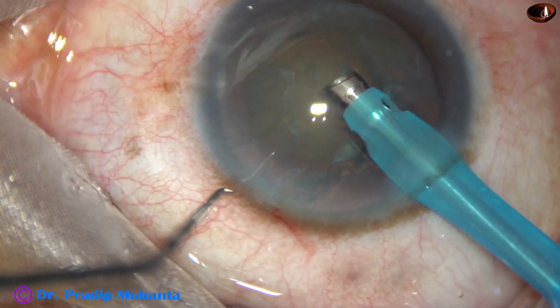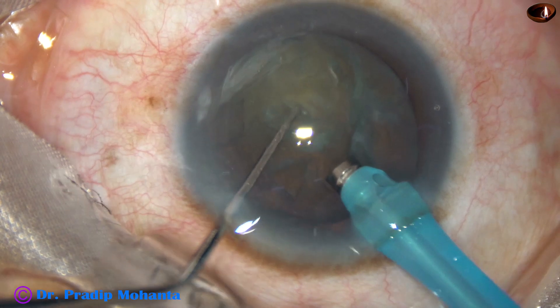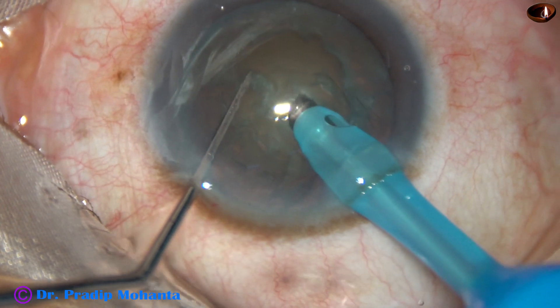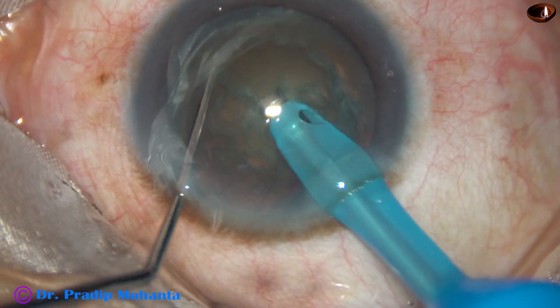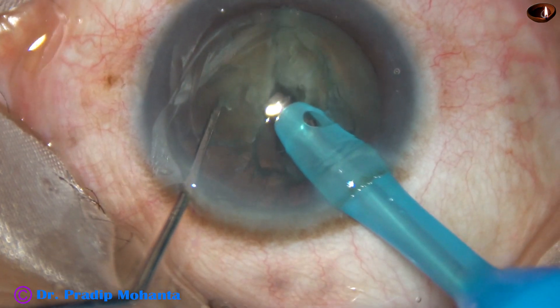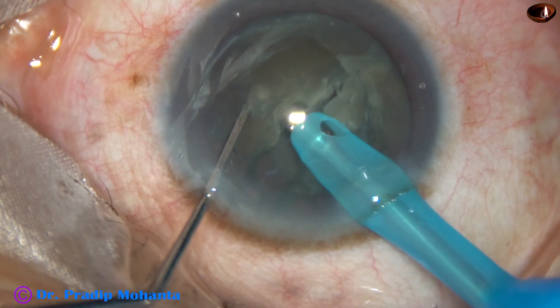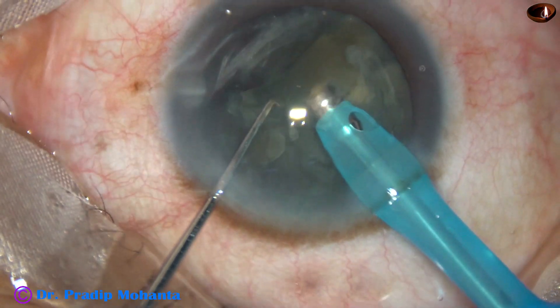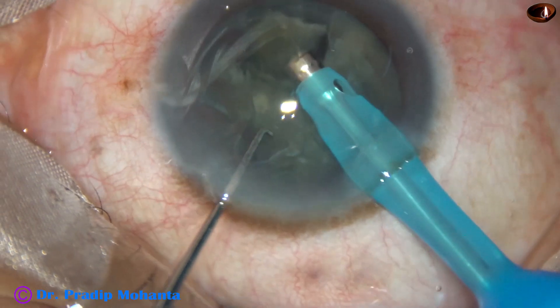We can see this is a cataract with grade 3 nuclear sclerosis. And this is direct chop — just bury the tip into the substance of the nucleus and chop it. Bury at another place and chop. The free nuclear fragment is emulsified and removed.